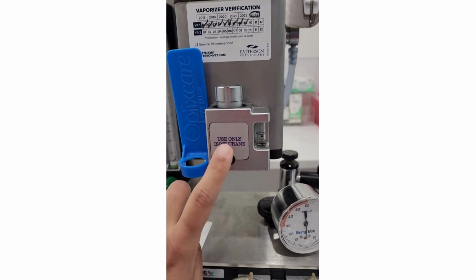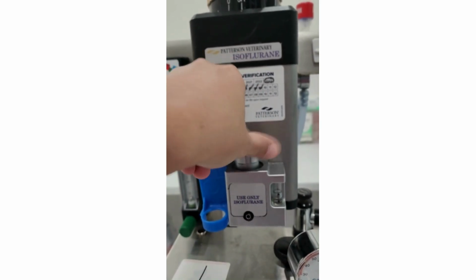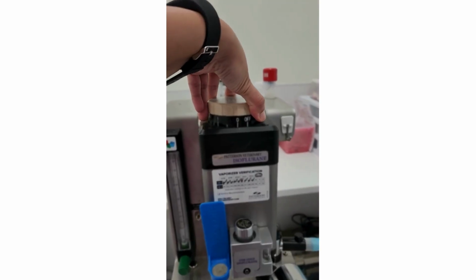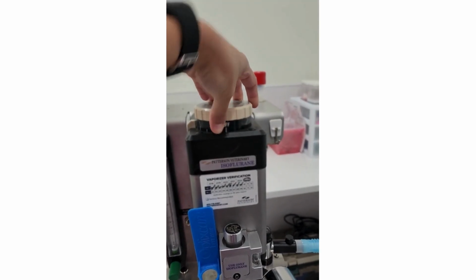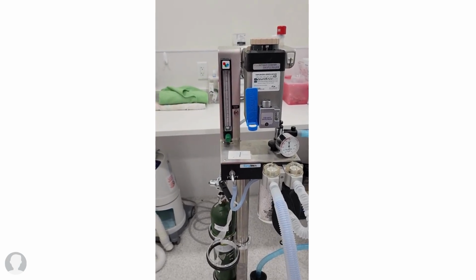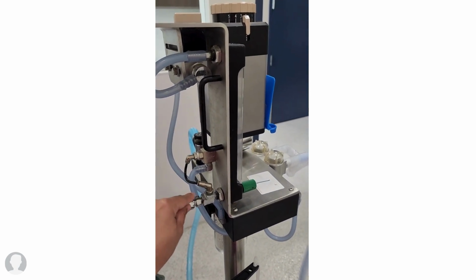Here you have a closer look at the vaporizer. In the bottom, you can add the liquid anesthetic, and then in the top, you can regulate the amount of gas that you're going to be giving to the patient. The second path will be the oxygen flush valve. Here, the oxygen will bypass the vaporizer to deliver fresh oxygen at about 50 psi.